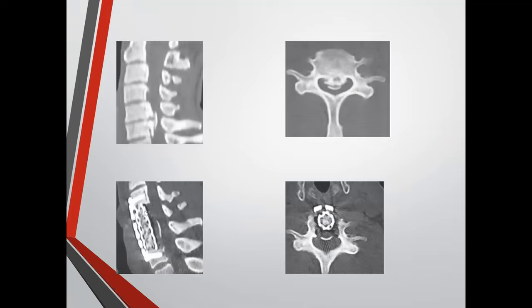Now, this kind of case, see, this is a cage. I am very much against these distractible cages, because with distractible cages, you fill the bone inside, and once you distract that cage, that bone is floating. So you're never going to get fusion. You're going to rely on the implant for the rest of your life. So a mesh cage is far superior, packed with a lot of bone, which ultimately is going to fuse with the vertebra above and the vertebra below, rather than a distractible cage.